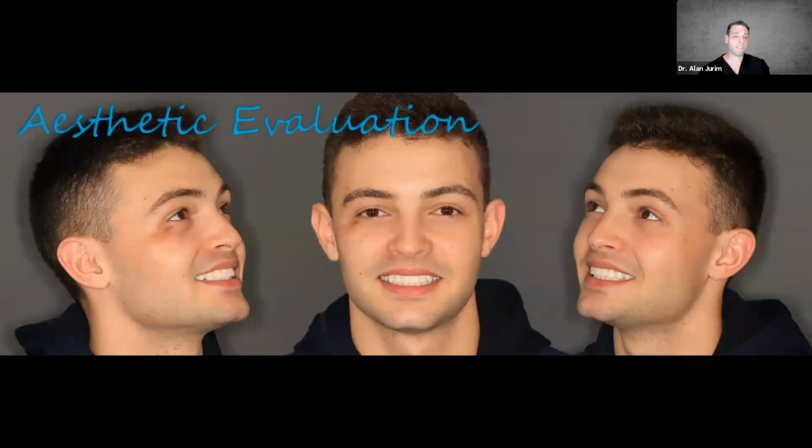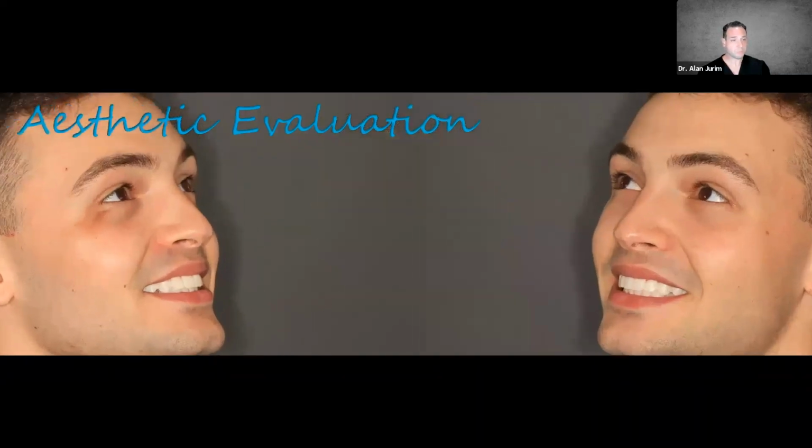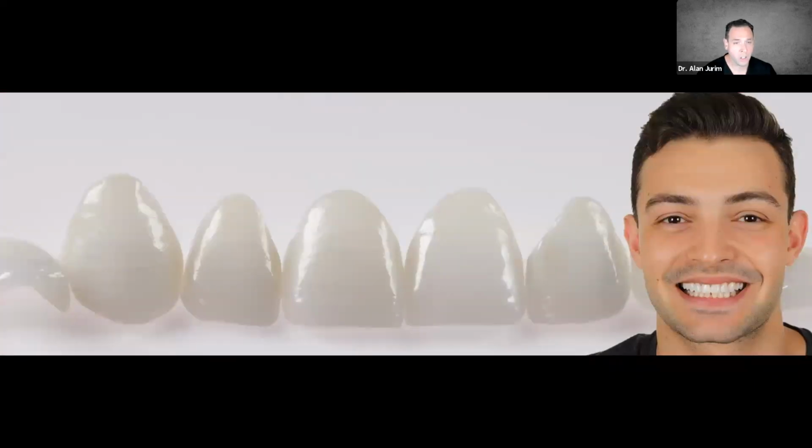This is also very valuable because it teaches the patient, and it teaches myself at the same time, as to maybe where we want to end up. So in a case like this, where we're doing our aesthetic try-in, I noticed the incisal edge of number 6 is maybe a little bit long. Maybe that's something I want to change. But these are our influencing factors as we progress through the case. And so when we get to our finals, we've test-driven the smile and we know just where we want to end up. This case I did, I believe, around 3 years ago now.